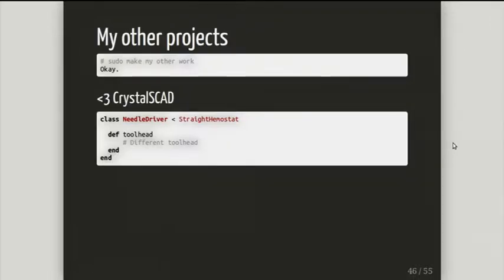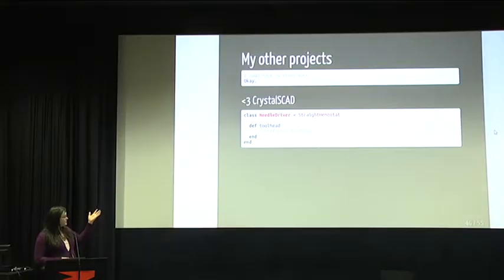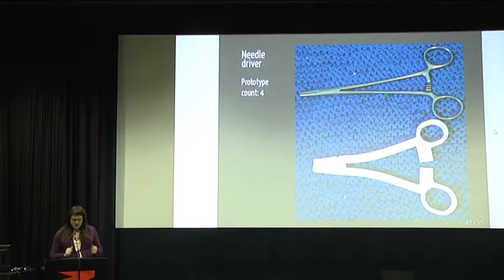Now going to the other tools I need to make. I love my CrystalSCAD thing because I could just inherit the things I need, copying most of the stuff — like I just overwrite the tool head and have a different tool with the same underlying structure. Though that wasn't completely true about the needle driver.